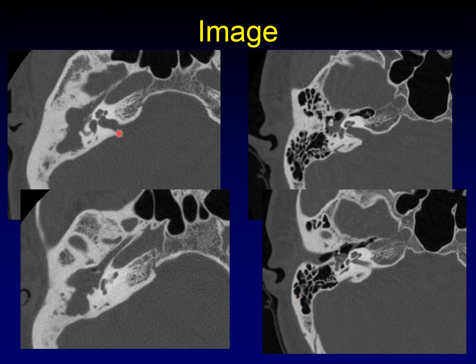In patient number one, the ossicles have been completely eroded away — there are only little wisps of bone left behind. In patient number two, the ossicles are intact. You can see the malleoincudal joint here, and you can see the incudostapedial joint here.